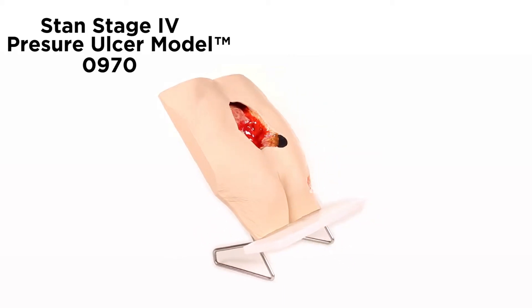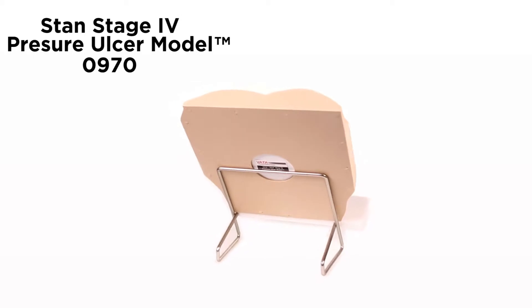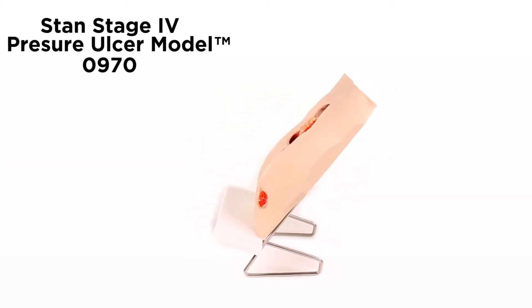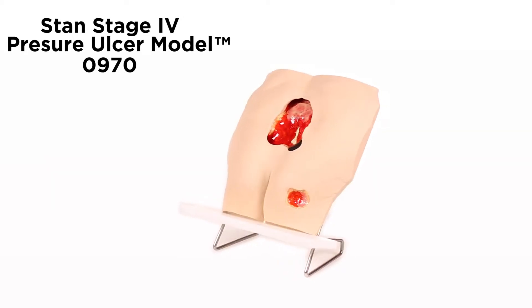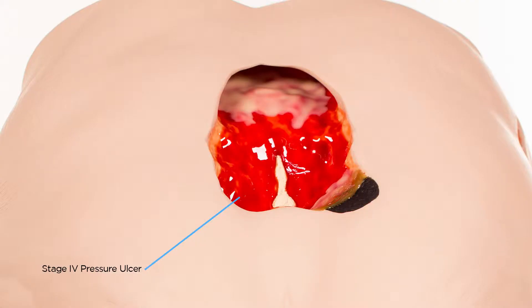Stan Stage 4 Pressure Ulcer Model Number 0970 is a smaller version of our very popular Seymour II Wound Care Model 0910. Stan was molded from a 74-year-old woman with amazing detail — a large Stage 4 on the coccyx displayed with some eschar on the edge and slough traveling down into the wound.